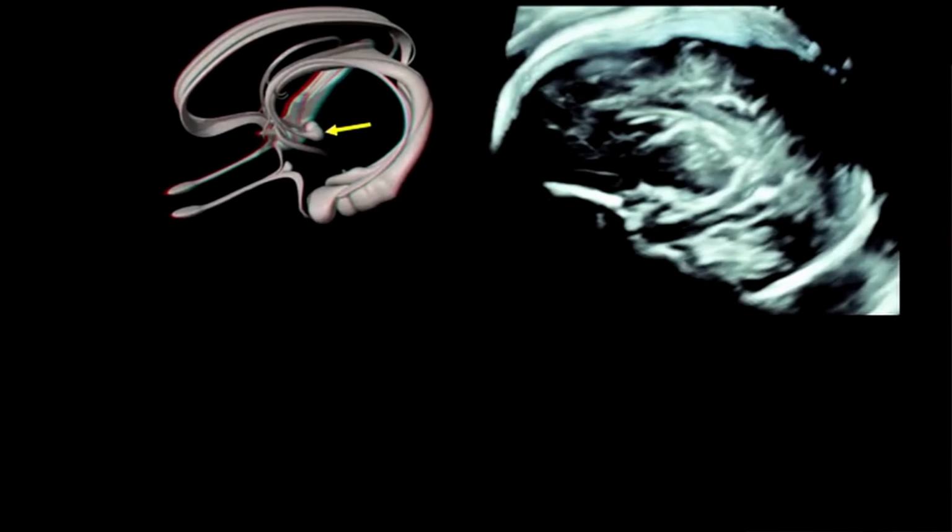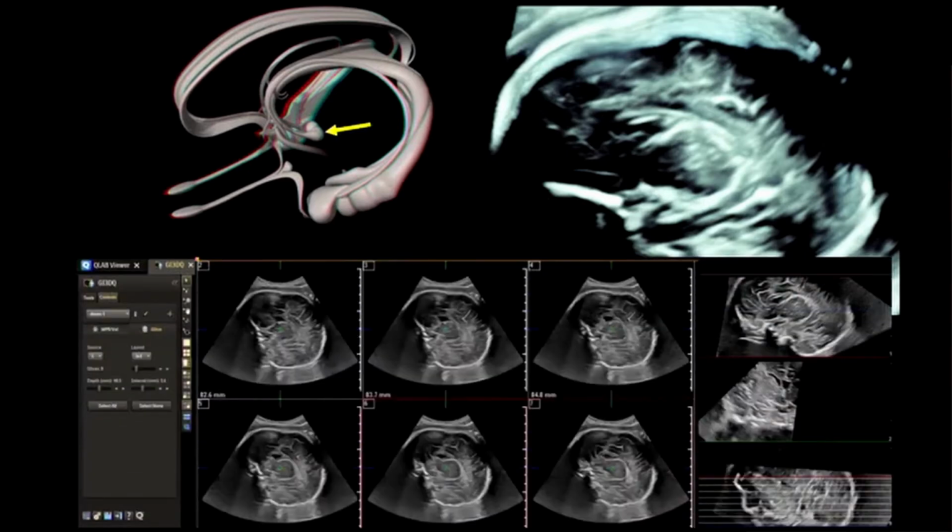and can be followed all the way down to the mammillary body, but you must change your orientation and your location from the outside to the inner sagittal plane. This can be accomplished by utilizing the eye slice or TUI features of whichever machine you're using. And then you walk inward in increments of 1 millimeter or less to identify where the hippocampus is coming over, and then the fornix, which dives backwards and inward.